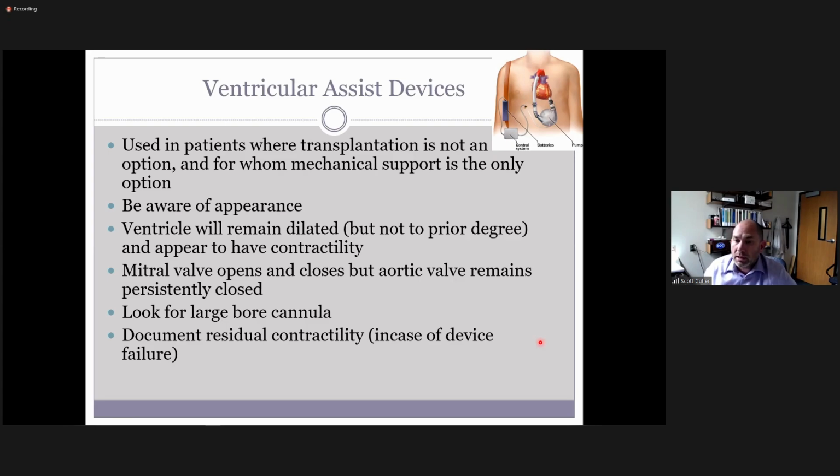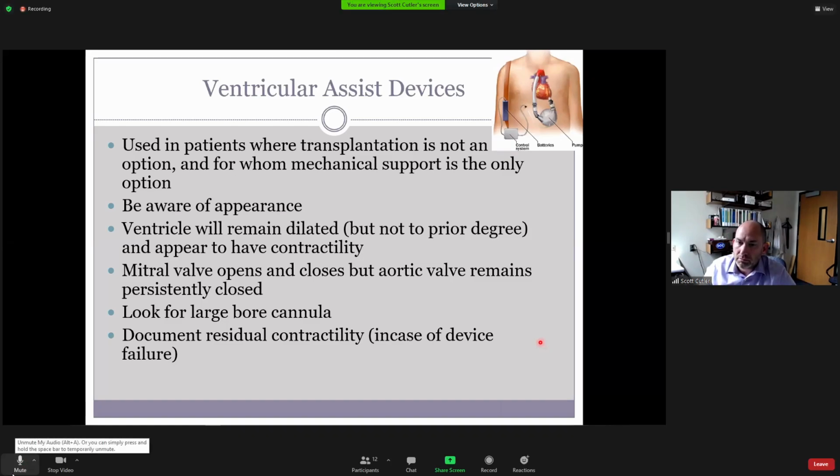Possibly, yes. It doesn't totally, because the valve itself is pretty fibrous tissue with a very light layer of epithelial type cells on it, like simple squamous cells. And again, these are basically terminal patients, keeping that in mind. You're not expecting a life expectancy of 20 years after they implant one of these. It could do some damage, but the valve is still functional. It's just being held shut by the pressure. So if you were to turn that off or the pump fails, typically the aortic valve still opens up and operates as it did before. Does that answer your question?